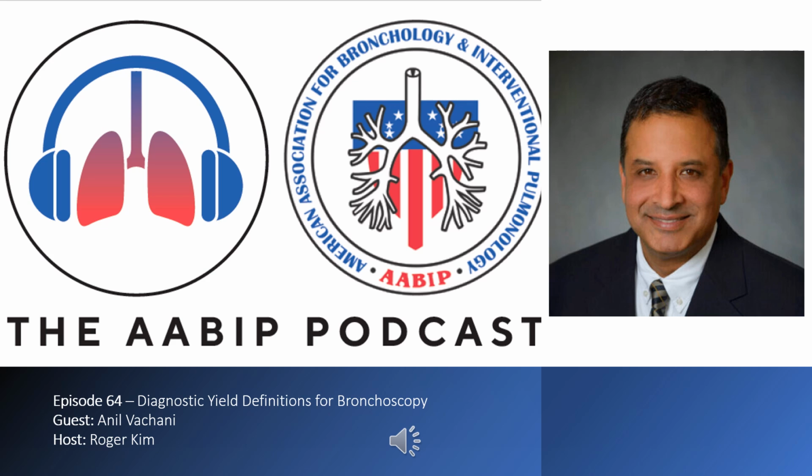Yeah, it's a great question, Roger, that you've raised. I think the work that's been done in the field so far has raised the issue of prevalence of malignancy influencing diagnostic yield. I don't think it's yet offered a solution, nor does the statement from ATS-ACCP yet offer a solution for how we think about this. I agree with their recommendations that every study should report yield, accuracy, and prevalence so that we can, at the very least, be as transparent as possible in understanding the underlying population and then assessing what diagnostic yield means in that context.